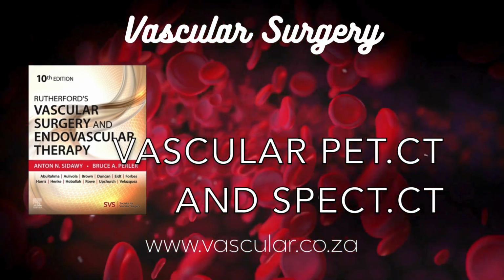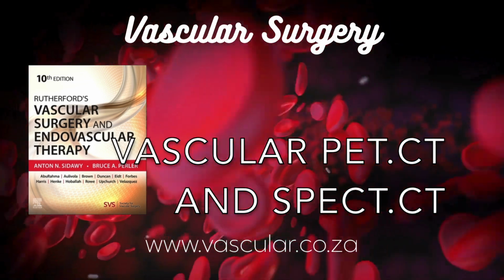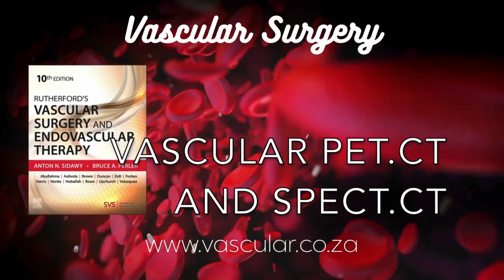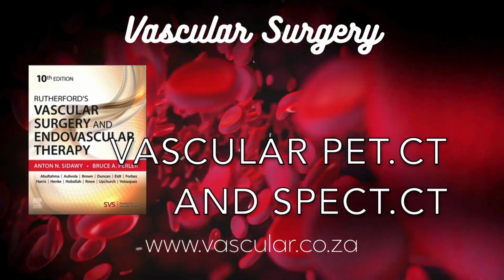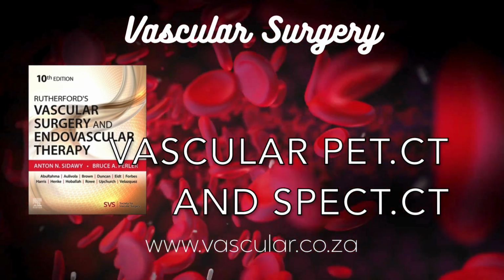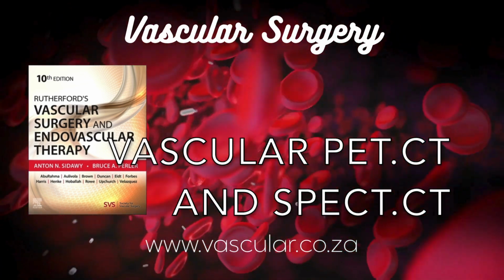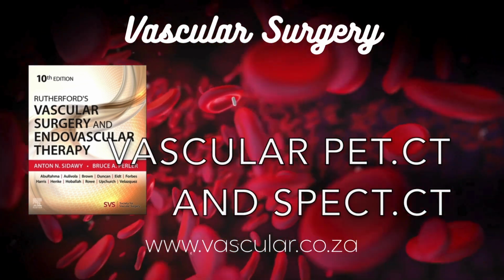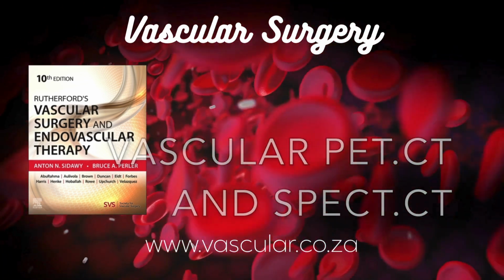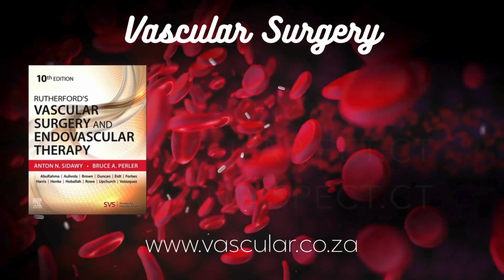Great. Now another tricky area, vascular graft infections. How does molecular imaging help here? This is another major application. Diagnosing infection in a prosthetic vascular graft can be really tough with just CT or ultrasound. Molecular imaging helps determine if nonspecific findings on those scans are actually due to infection. Which techniques are used? Labeled white cells, FDG. Both are used. As we discussed, labeled white blood cell scintigraphy, WBC, is a classic technique for infection. But FDG-PET is increasingly used and often preferred.